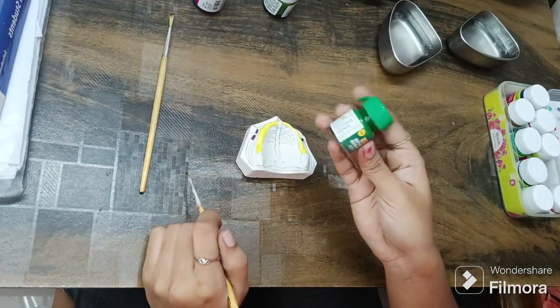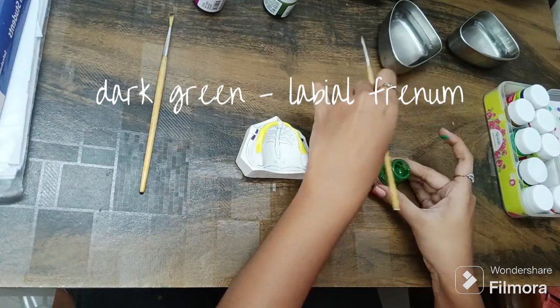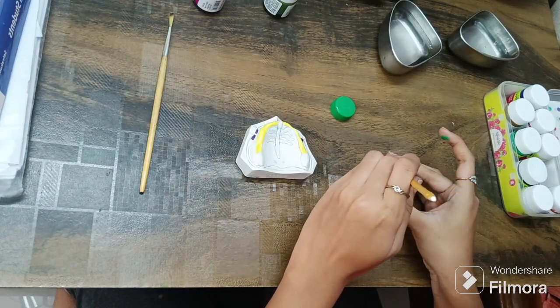This is dark green poster paint. I will be using this for this part. Comment down below how many times it took you.